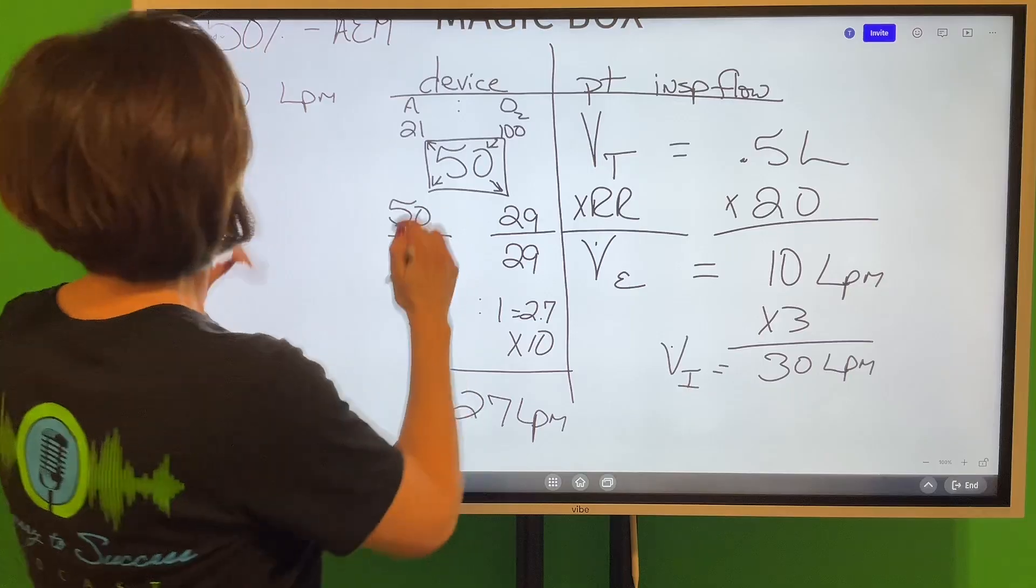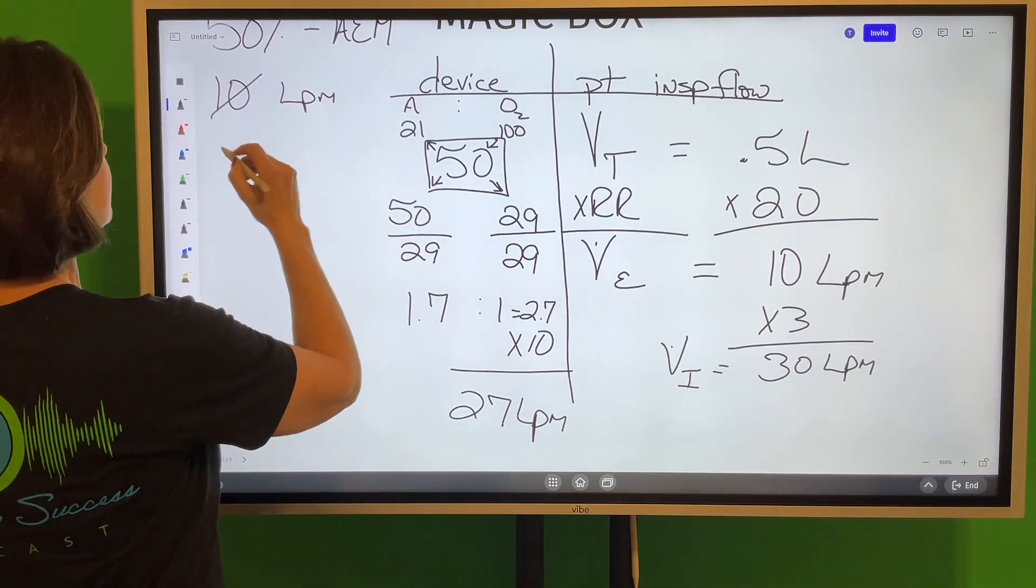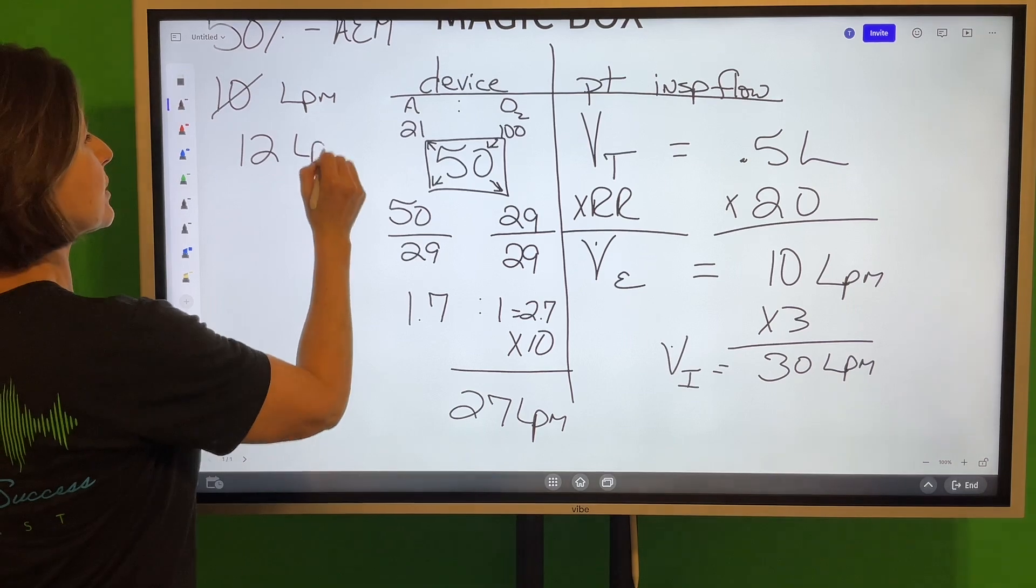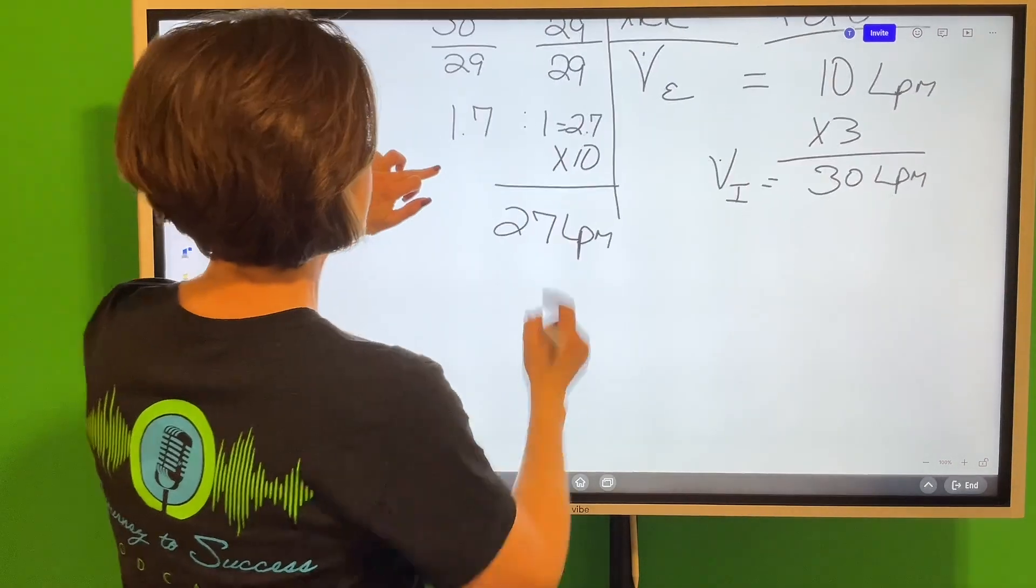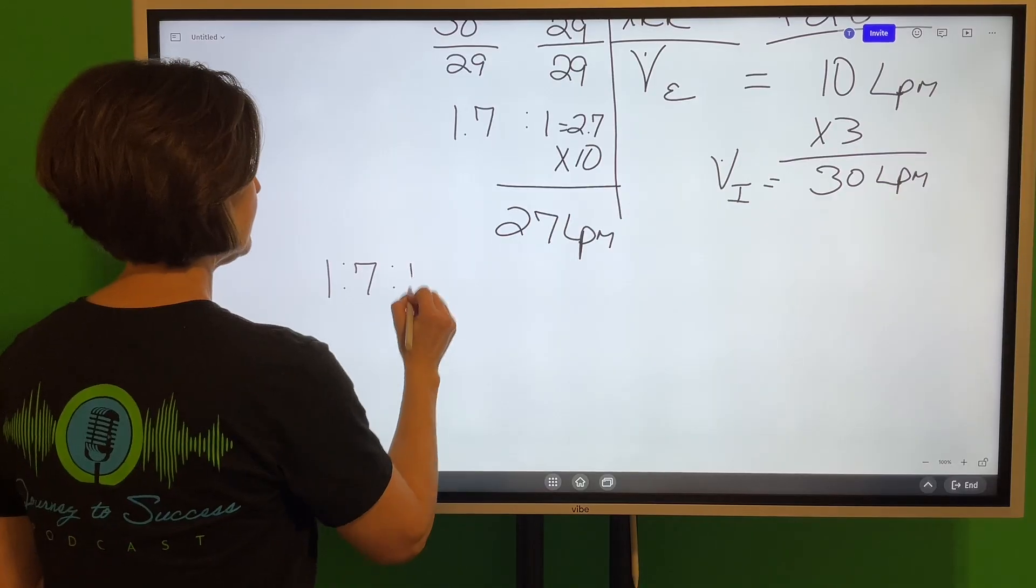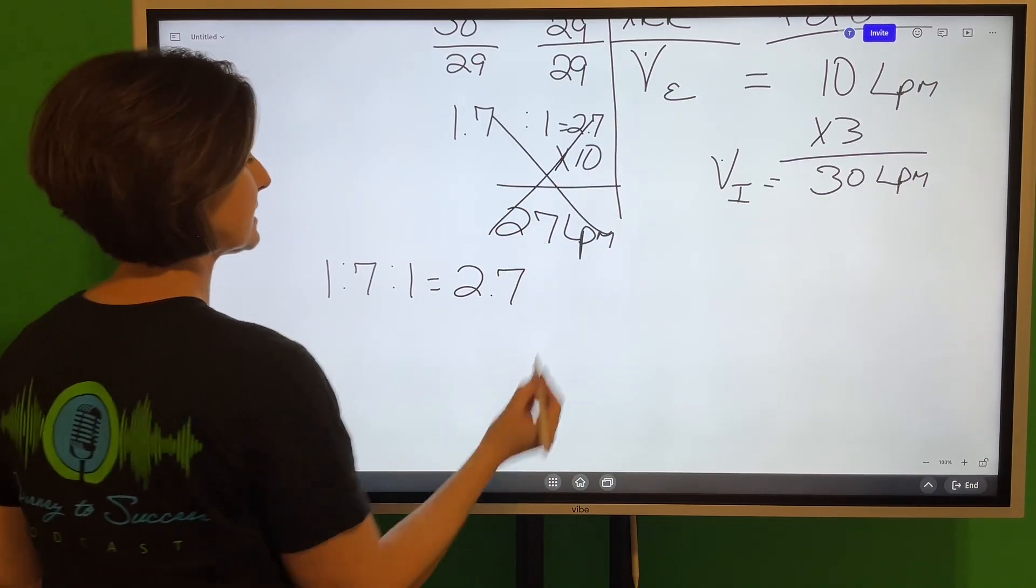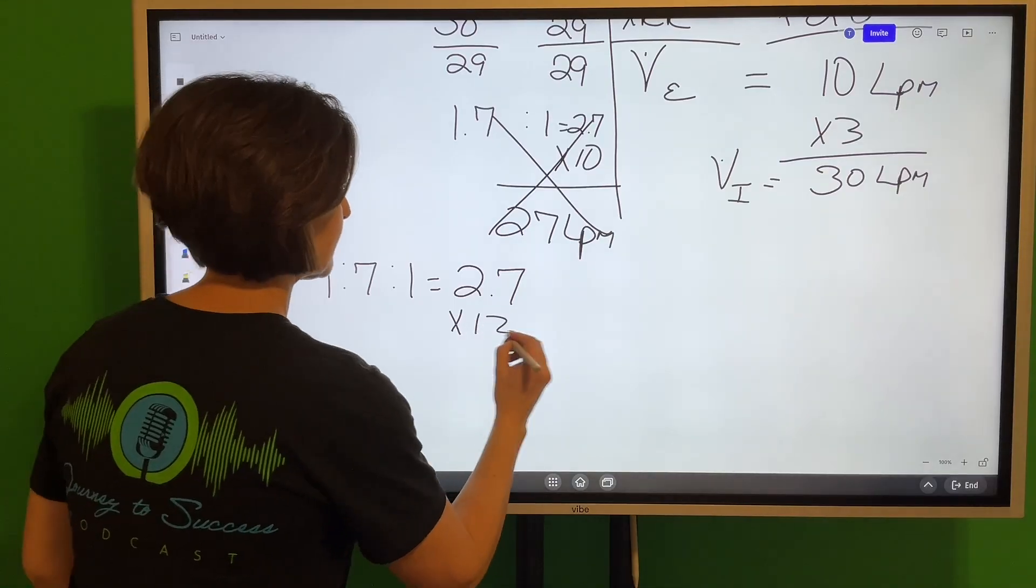We can fix this super easy. All we have to do is turn up the liters per minute on the flow meter. Instead of 10 liters a minute, let's go to 12 liters per minute. Now remember, our air to oxygen ratio is 1.7 to 1. Add those together, it's 2.7.